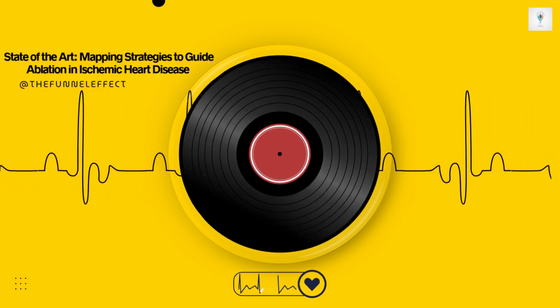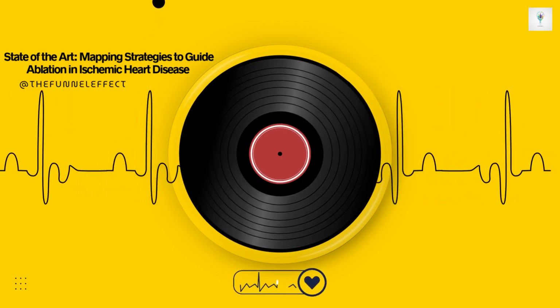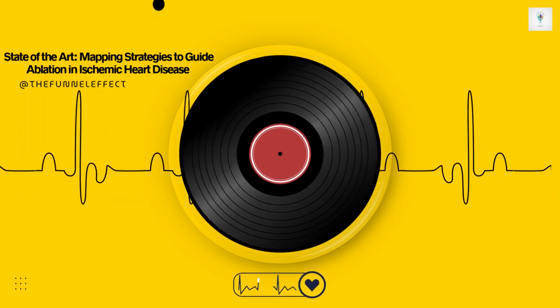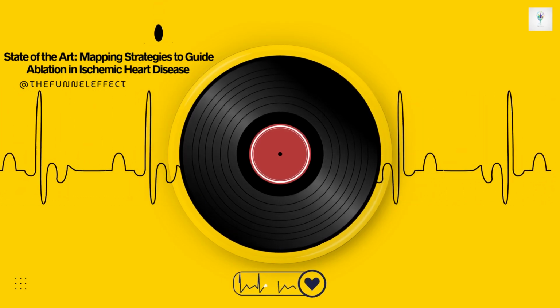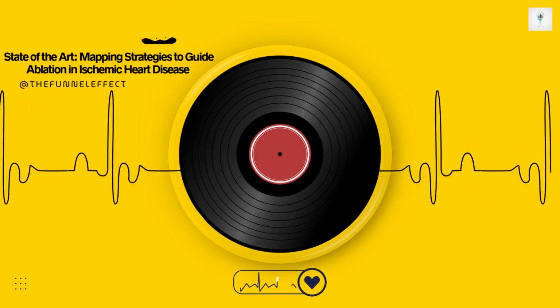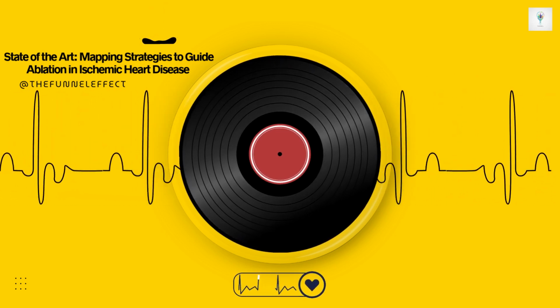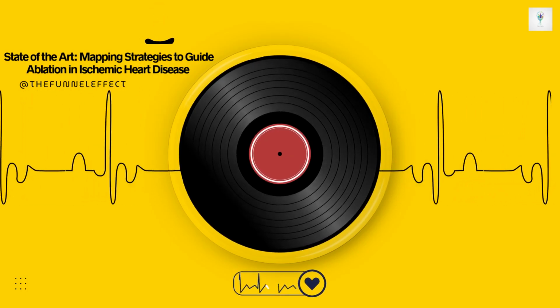Exactly. And what's really deceptive is how these deep intramural circuits can sometimes behave electrically. They might exit onto the surface at just one tiny spot. So when you map it from the endocardium or epicardium, it might look like a simple focal VT, like it's starting from a single point. But in reality, it's the exit of a complex, deep re-entry loop. We always have to consider that the surface map might be hiding a deeper storm.